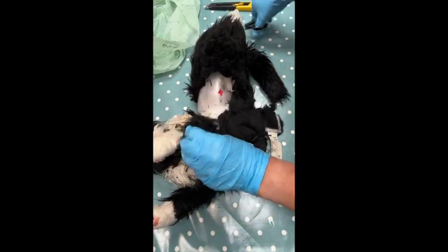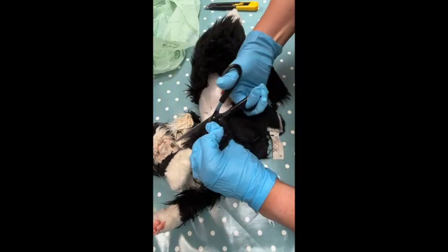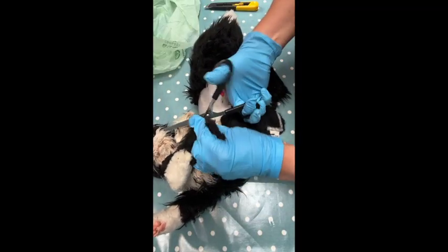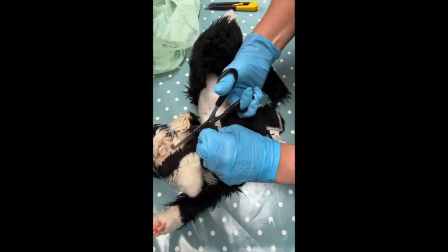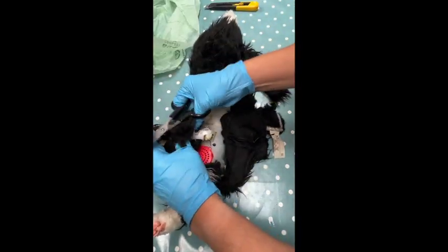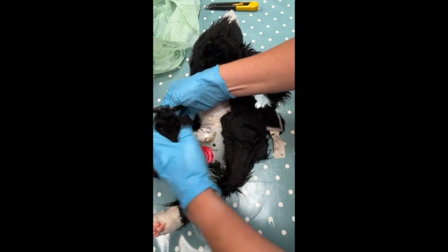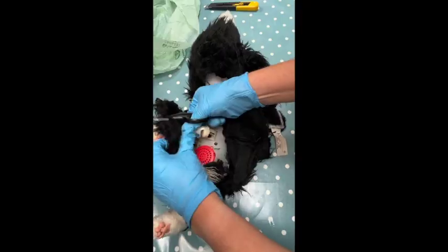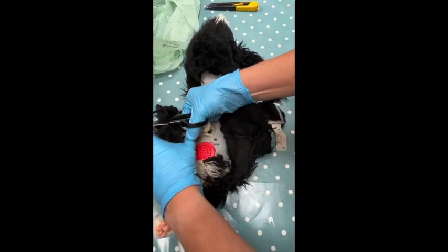Let's have a good look at this paw. See how they're fixed on, whether we can ever... I always wonder if we can actually just take the whole fur out or off at some point on a future cat, obviously not this one, and then put it through a washing machine or something. God, they're pretty welded in.